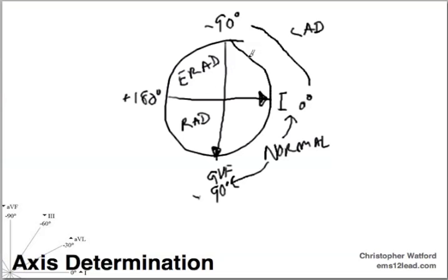Now you'll notice on left axis deviation, I've not drawn it inside here, because actually we have 2 parts. And that's split by AVL. Right? If it is from 0 to negative 30, this is normal or physiologic left axis deviation.